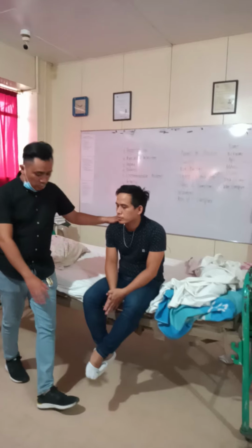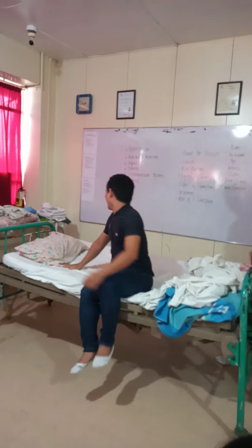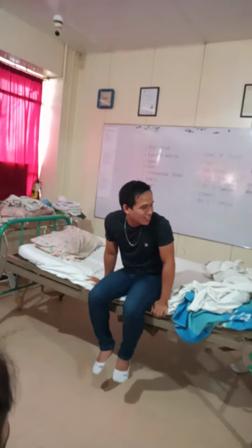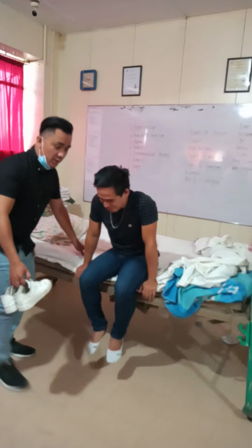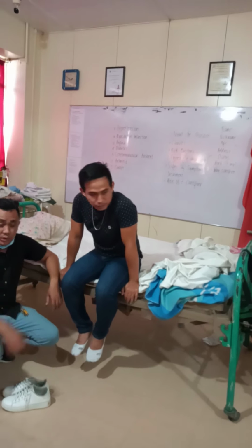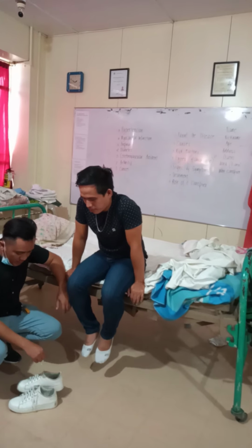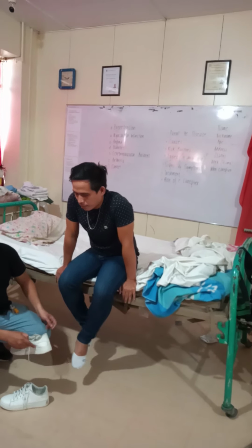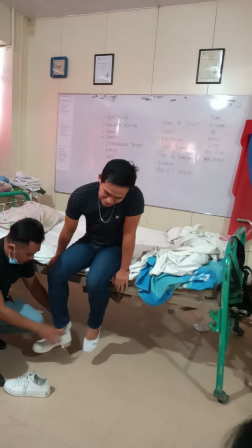Gets? Alright. Next one is sapatos ni patient. So kita niyo mong taon sa sapatos ni patient. Ayaw mo kagol when it comes to the shoes sa mga clients who are using wheelchairs. Most of their shoes are they're using kana mga slip-ons lang or kanang Crocs pareha na yung gisuot. Okay? Nihit na kayo mo makita o kanang mga clients or mga patients na mugamit o kanang mga shoes with shoelace. Kasagaran na nila mga easy to wear na gina mga shoes na ginang suot.